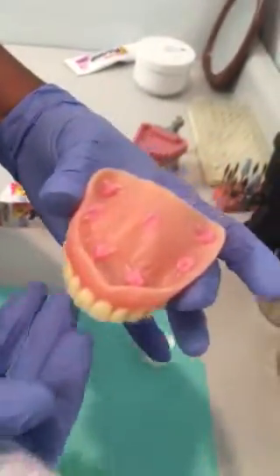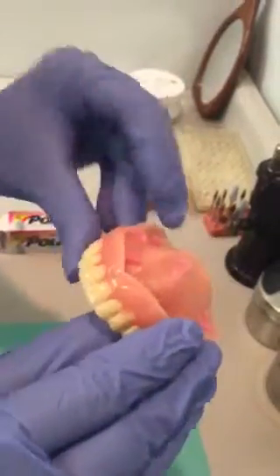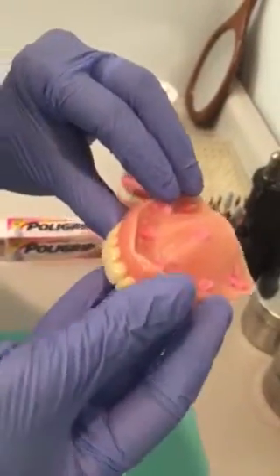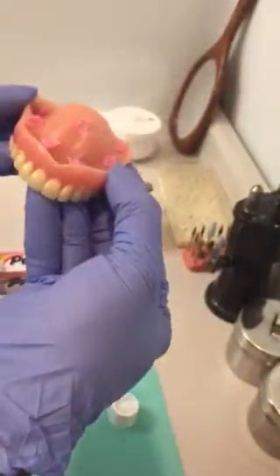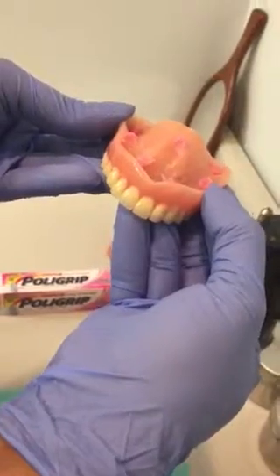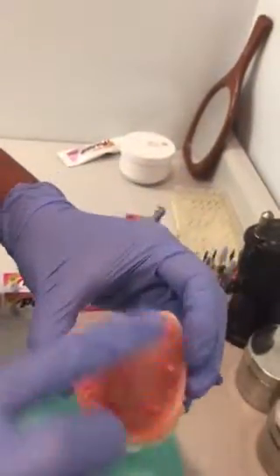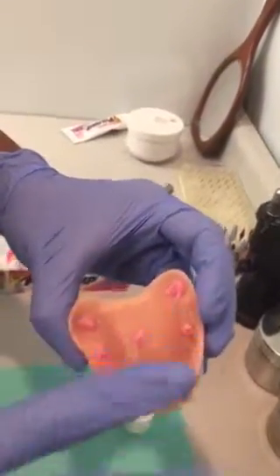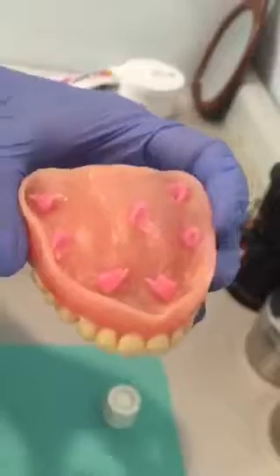You place the denture into the patient's mouth and use your thumb and forefinger to hold it in place for about a minute, then release. You also have to make sure the surface area of the denture is very dry before you do the application.